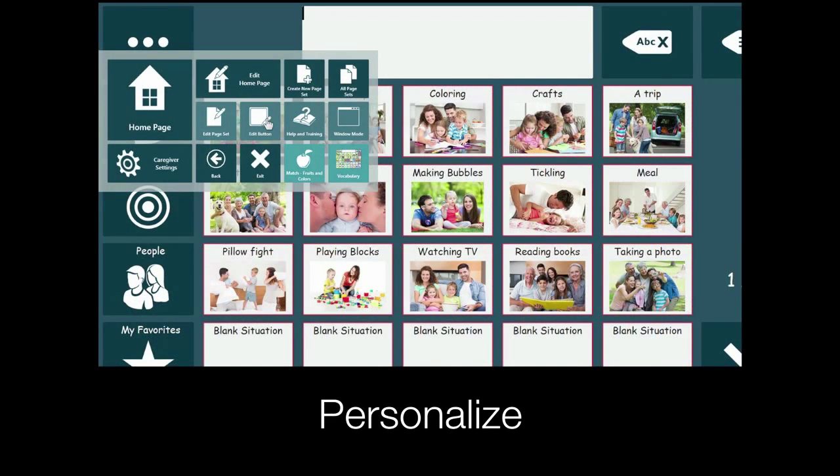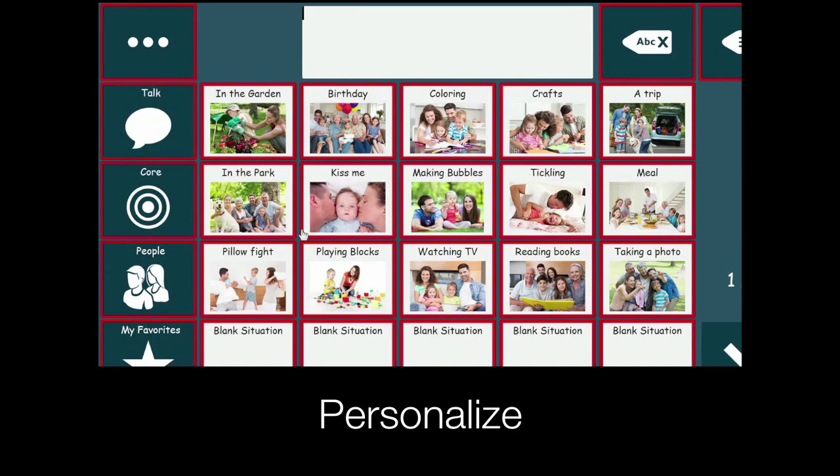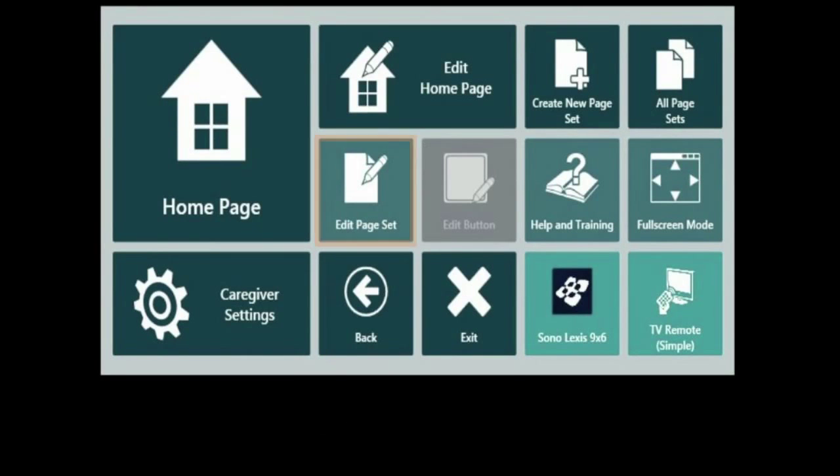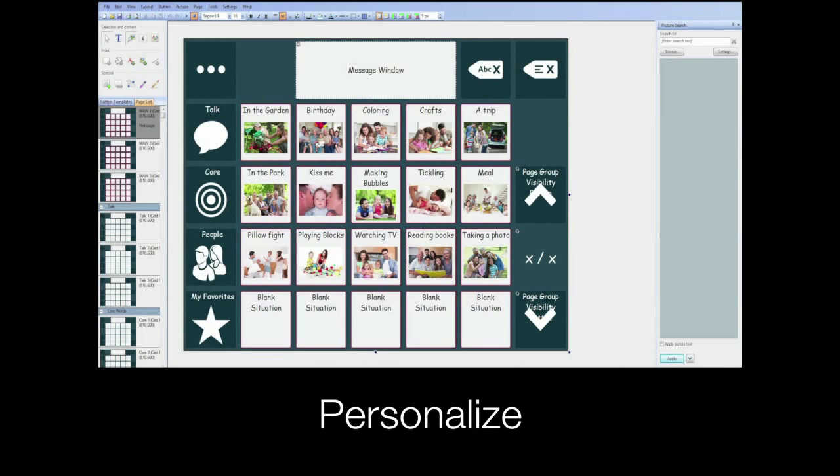You may want to personalize your page sets. Select here to quickly edit a button on a page and here to enter full edit view.